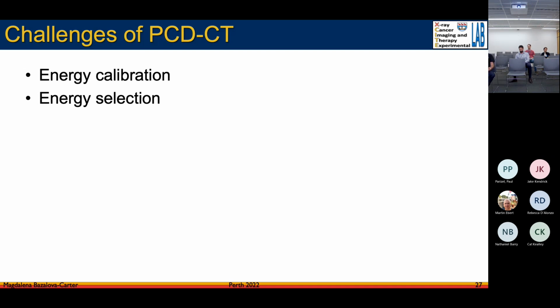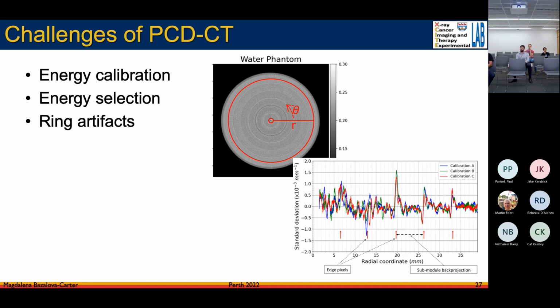And from what I understand, even the Siemens CT scanner basically serves as a dual energy CT. So even though there might be 5 thresholds or 5 energy bins available, I believe the manufacturer did not enable that function. So you basically end up with dual energy CT as opposed to photon counting detectors. So that's something that I think people have to figure out, and maybe also show that this is beneficial.